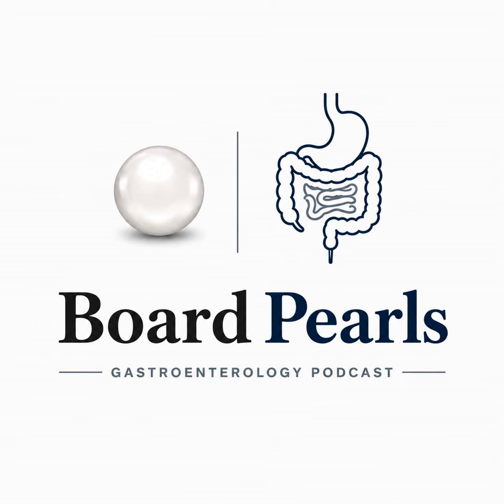The third domain is capsule endoscopy, which is best taught through the procedure's failure mode. The capsule is a swallowed wireless camera that traverses the gastrointestinal tract and transmits images, and it visualizes small bowel mucosa that conventional endoscopy cannot reach. The capsule is rigid, 26 by 11 millimeters, and once swallowed it cannot be retrieved unless it lands somewhere a scope can reach. Failure of passage is the dominant complication, and that complication is called retention.